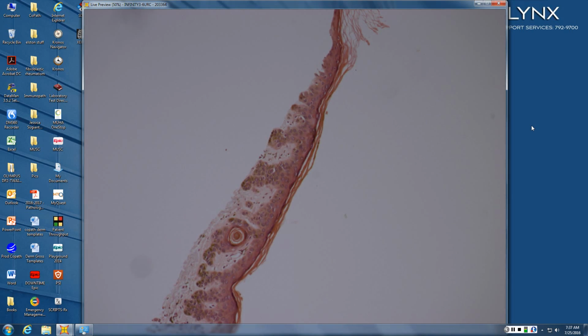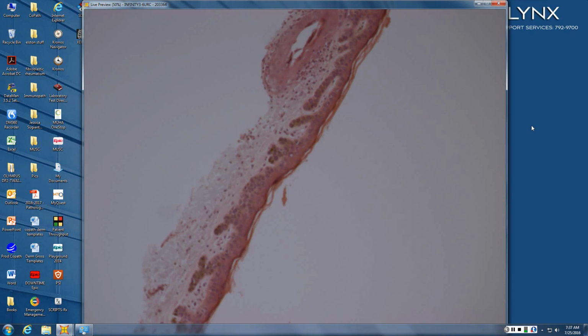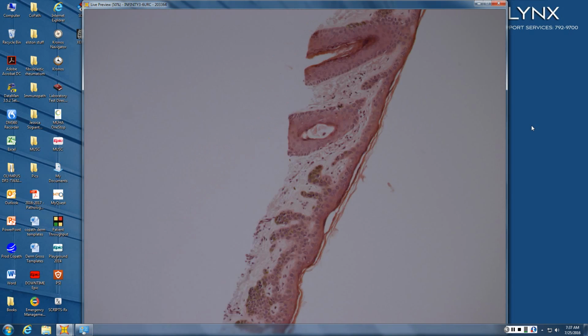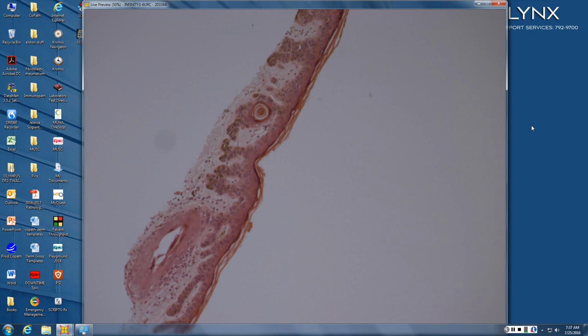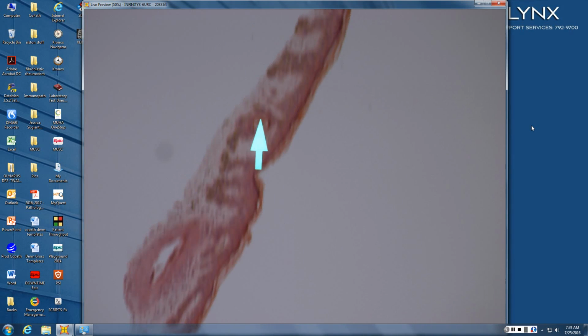Looks like we have a little baby seb there. Like a little baby seb. Thin, but it's got a little horn pseudocyst, it looks like. Some of it looks rather lentiginous form. Yeah, lentiginous-form, which is a good word. So part of it looks like a solar lentigo, and then you have focal horn cysts, so that would make it a baby seb, like a reticulated seb. Yeah, but you can say that's alternative.